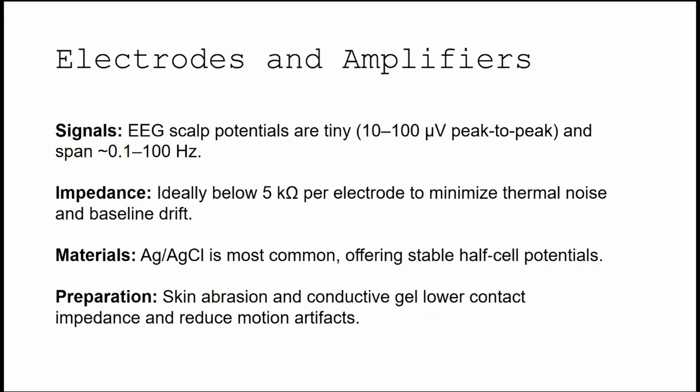So you cannot measure the current coming from the brain directly, but you measure the currents from outside the brain. So there's a kind of barrier, and this is what we describe as the impedance. And this is what we have to get low. If you have a very high impedance, we will not be able to measure the brain's activity, but we will get some noise signal.